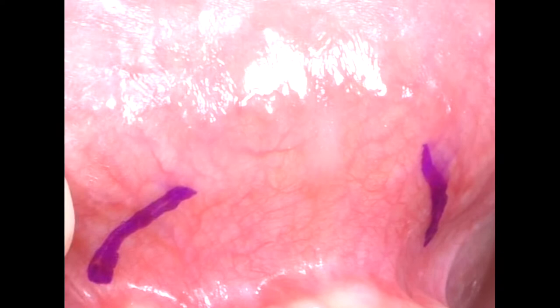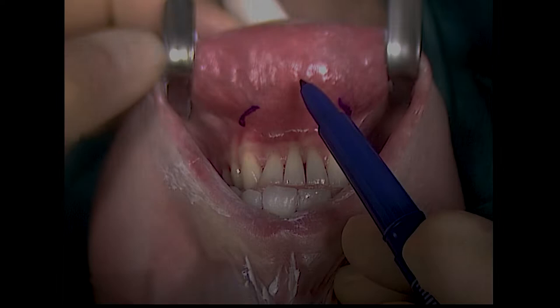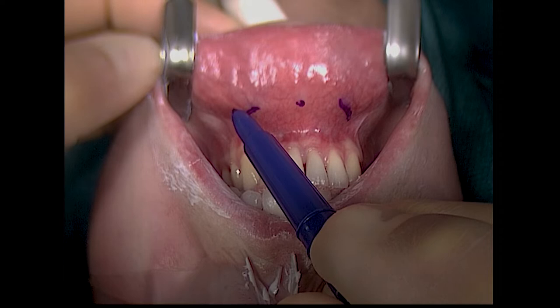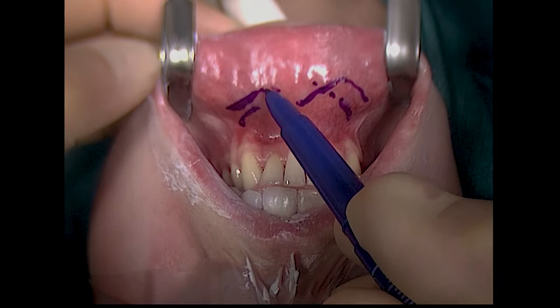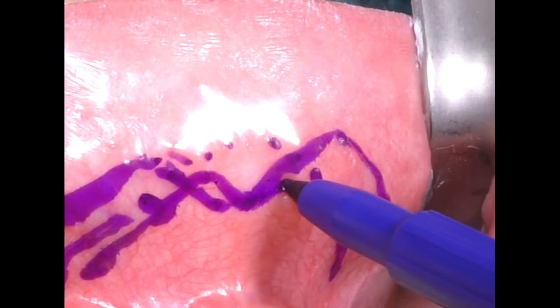I like to make an incision in the middle of the lip in order to avoid scar bonds in the vestibule, and the incision has a shape of an inverted W, the so-called royal incision. But in this case, as you can see, the labial branch is just running below this design, so I have to make a new one closer to the vestibule.